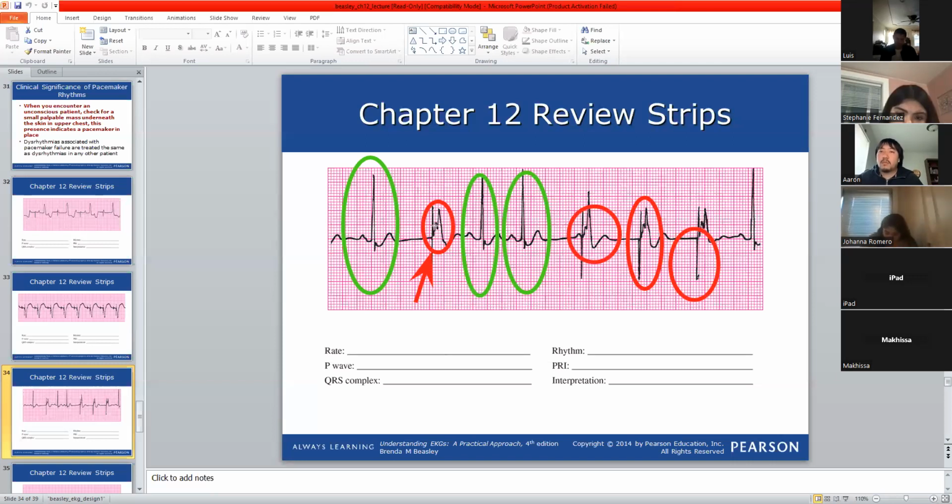So this means the wire is where? In the ventricle. Very good, correct answer. So far I have a spike followed by a wave. I have to look at the wave. Is this wave coming from the atrium? Then the wire is in the atrium. Coming from the ventricle, then the wire is in the ventricle. So here, we have a spike followed by QRS. Correct?